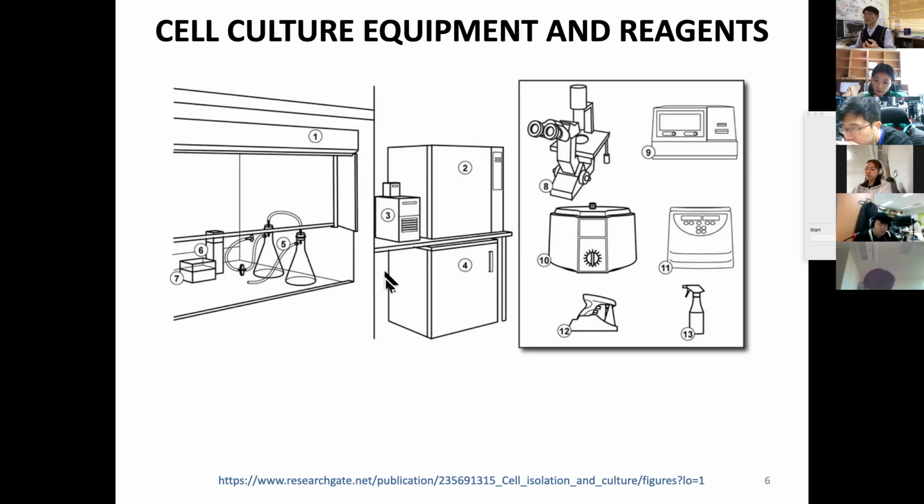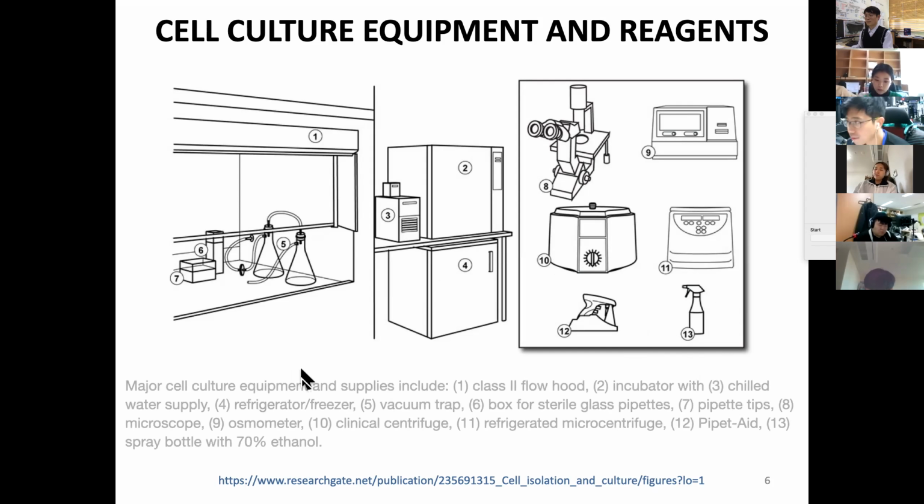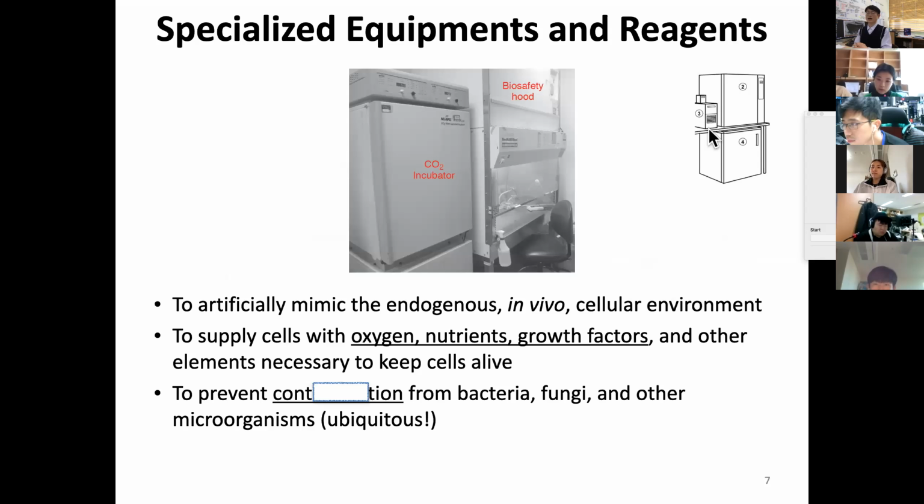Even whatever you bring from outside to inside this laminar hood, you are supposed to spray this ethanol to prevent any contamination. So I think I put some of the names over here. I rarely use this, but the osmometer measures the osmolarity. Okay. All right, so now let's see the real thing in picture.